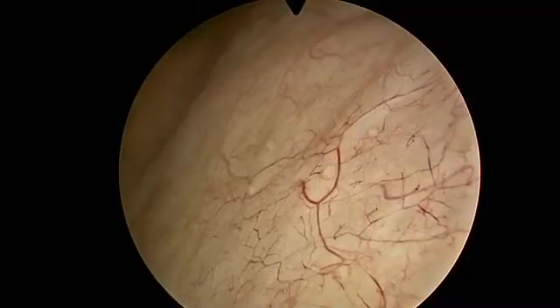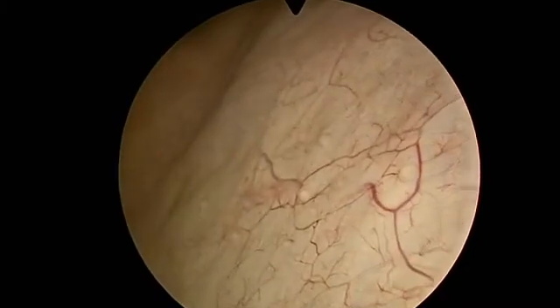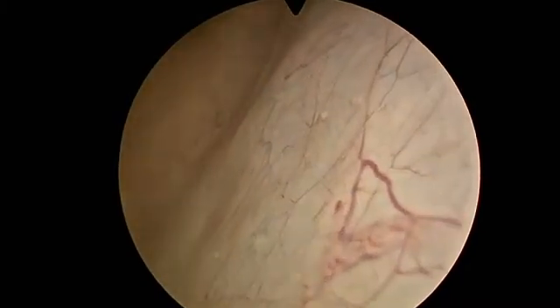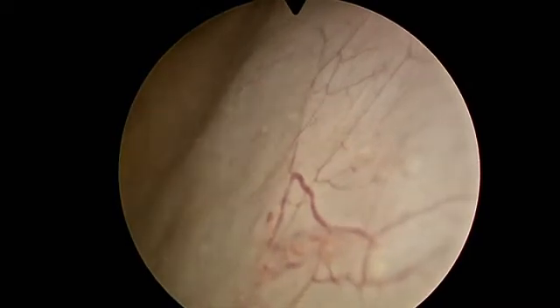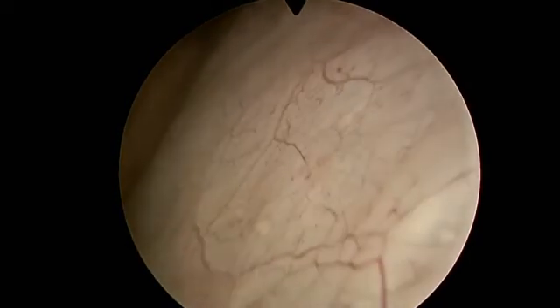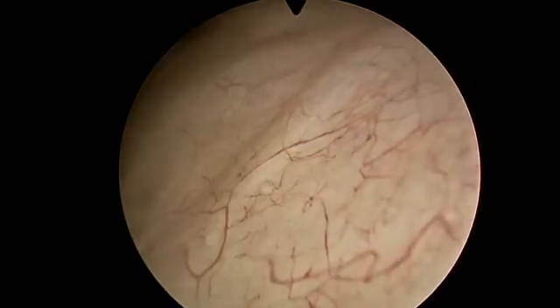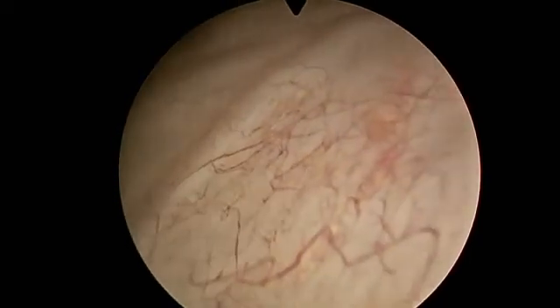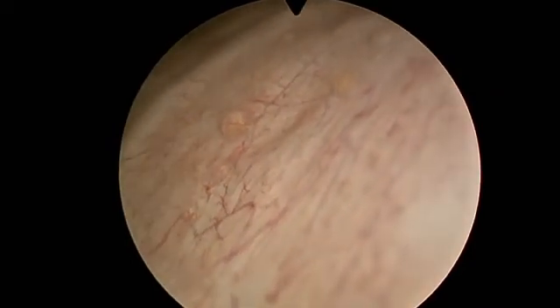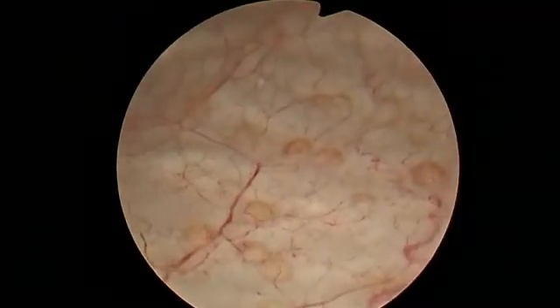During cystoscopy, one can see the many small, tiny, mostly clear but sometimes pus-filled vesicles sitting on the surface of the bladder. They are in fields next to each other, and without mucosal reaction of redness or inflammation when compared to the more common cystitis cystica.